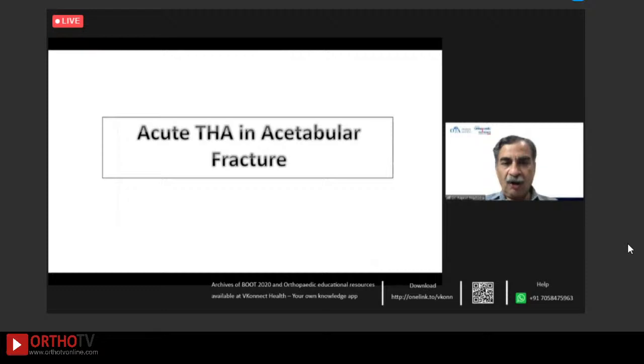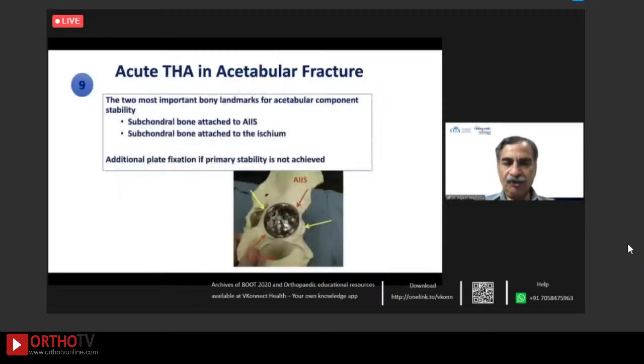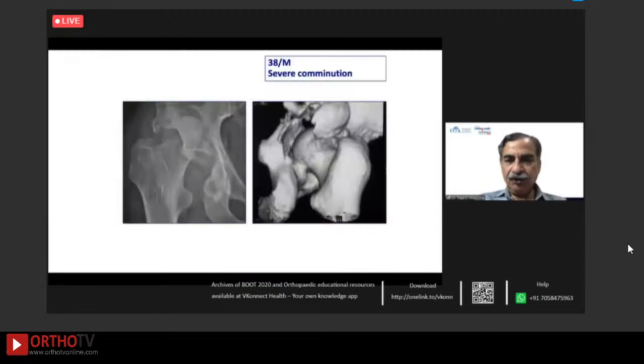Now, just going to talk about the acute total hip arthroplasty and acetabular fracture. Like I said, if you anticipate poor prognosis with fixation, the two most important bony landmarks for acetabular component fixation in these cases are the subchondral bone attached to the AIIS and the subchondral bone attached to the ischium. If you can wedge your cup between these two, you are good. So everything else is a secondary fixation, and this is the one which gives you primary fixation.